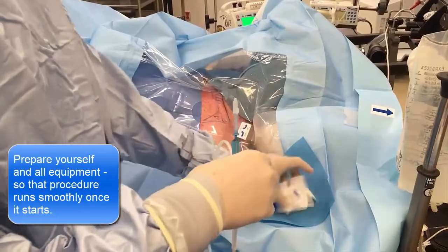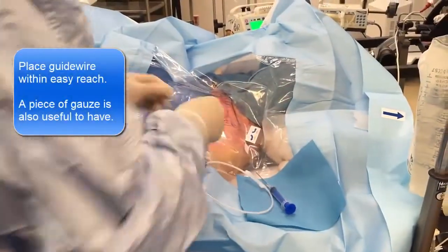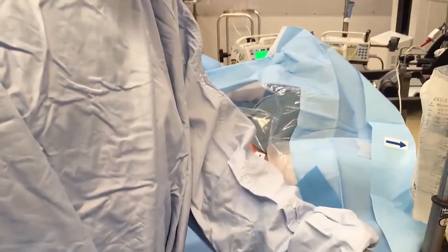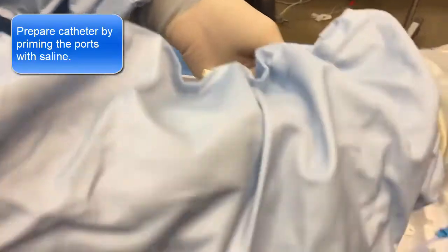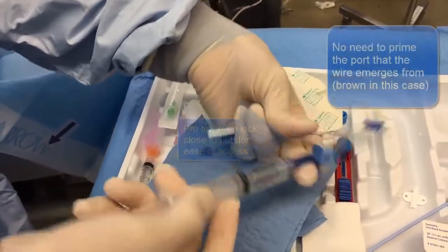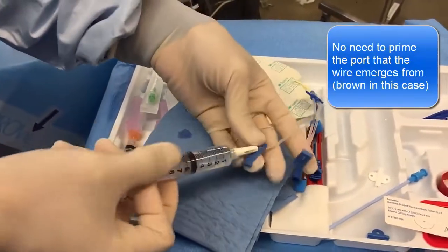We want to get everything ready — here goes. four by fours. Now let's just prime these lines. We won't prime the brown one because the little wire is going to come out of the brown one.